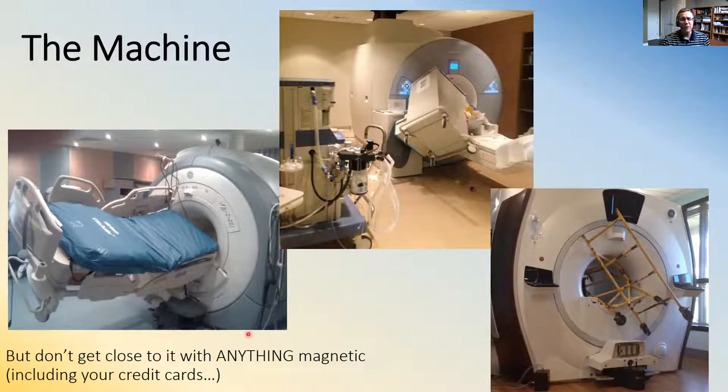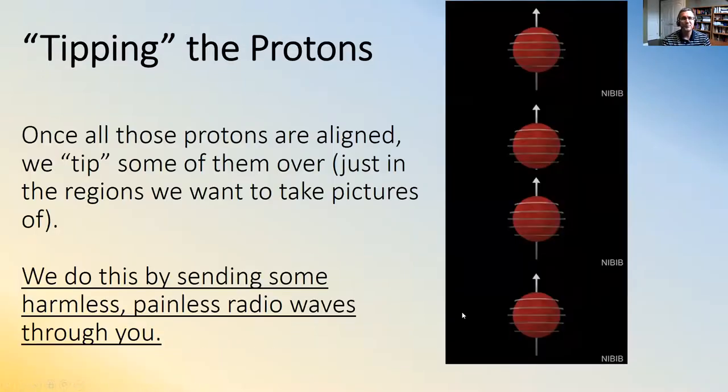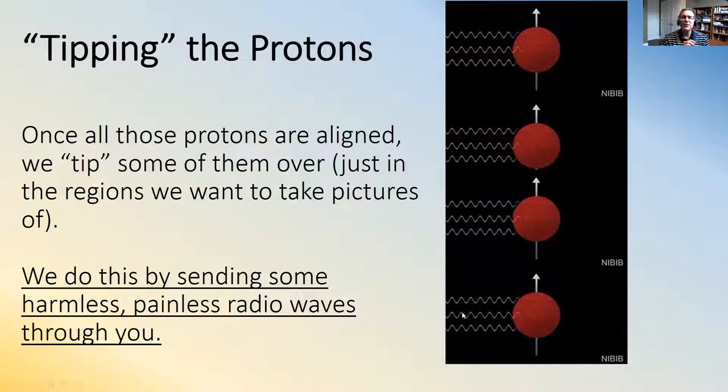And don't get close to it with anything magnetic, which would include your credit cards. You certainly cannot go in there with your wallet, or else that's called degaussing. All the magnetic strips on all of your bank cards will be completely erased. All right. So it's completely harmless to you as long as you don't have anything magnetic on you, which normally you should not. Okay.